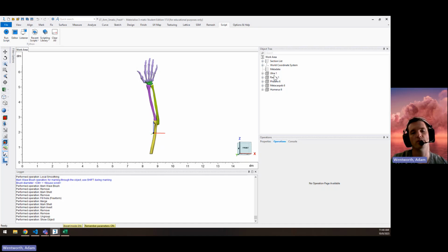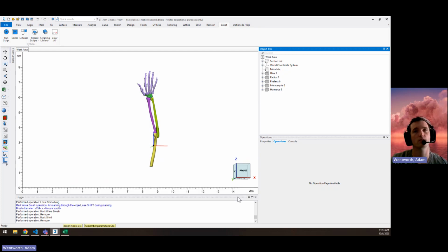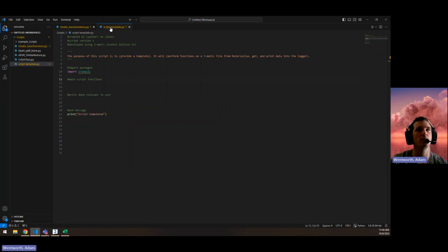They could have some segmentation artifacts like stair stepping, or they could have some mesh defects like flipped triangles or holes, things like that. They typically come in with these numbers at the end of the object too. And what we're using is Python as the programming language, which works with 3-matic, and we're using VS Code as an IDE to write our code.